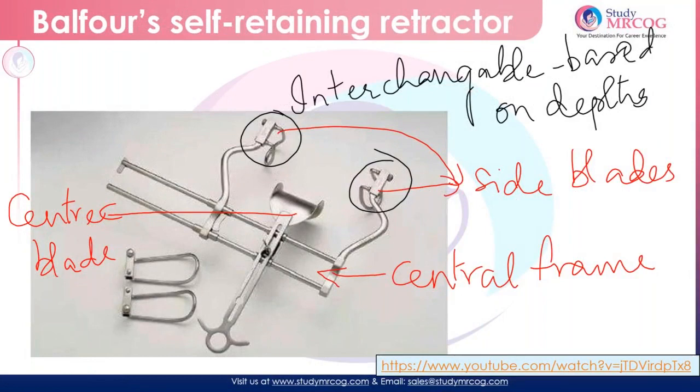Coming to the retractors that are used — there are two retractors which are commonly used in gynecological procedures. The first is a self-retaining retractor. If you can see, normally there is a central frame with two side blades. The size of these side blades can be changed depending upon the depth required. There is also one more size here. Taking out this, we can put this in its place. And there is a central blade to retract the bladder. So let me show you the Balfour retractor.